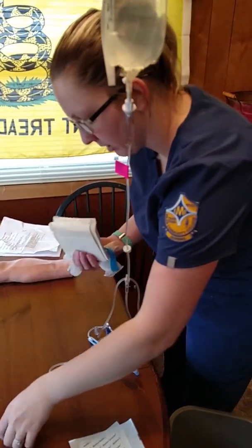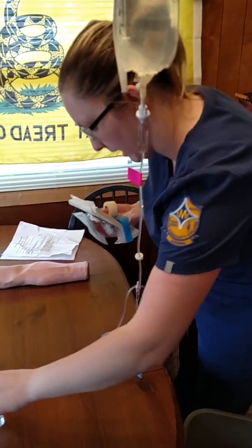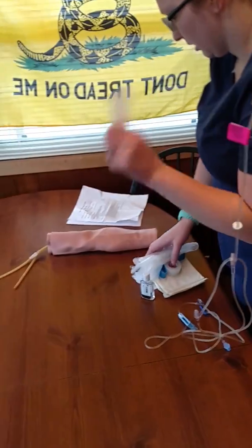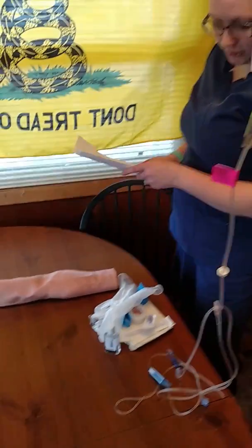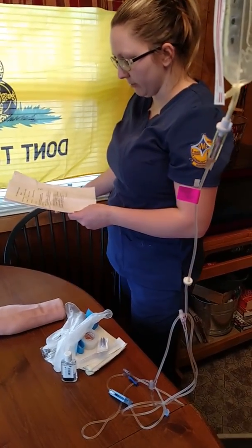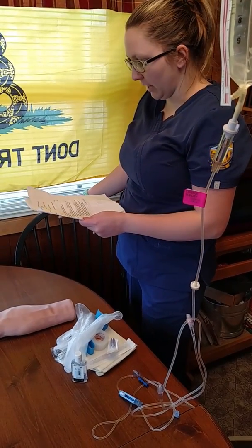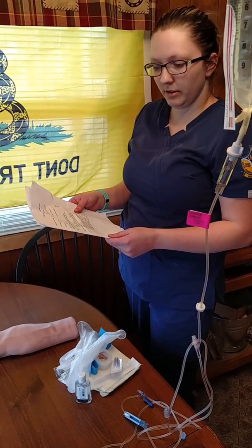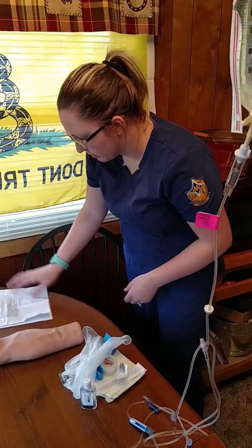Okay, so I'll gather my supplies here. Again, check the MAR for the order. We've already done that here to start the IV, so we're going to head to Miss Needed's room. Knock. Hi, Ivy. My name is Lee. I'm your nurse today, and it looks like the doctor has ordered an IV to get started with some rehydration and antibiotic therapy. Can you verify your last name and your date of birth? Needed, 6/2 of 88. Perfect, thank you.